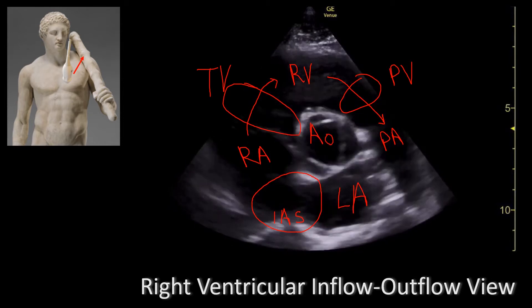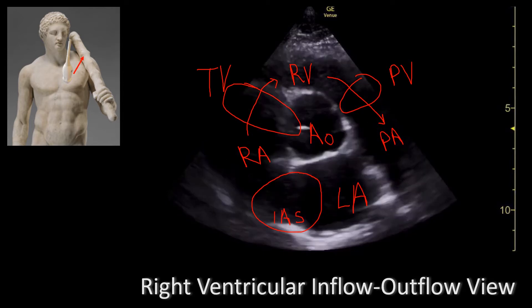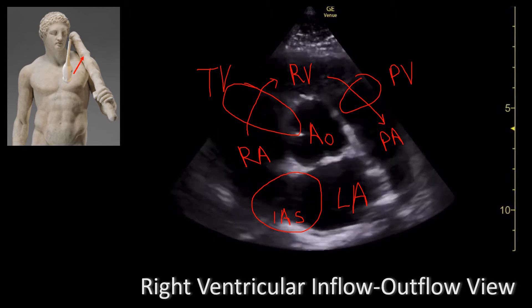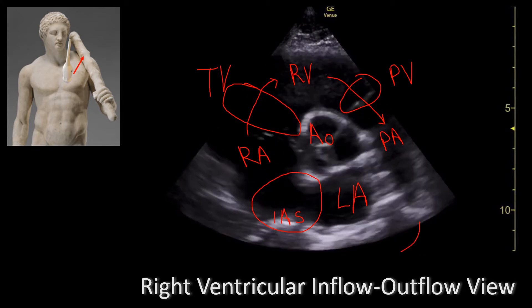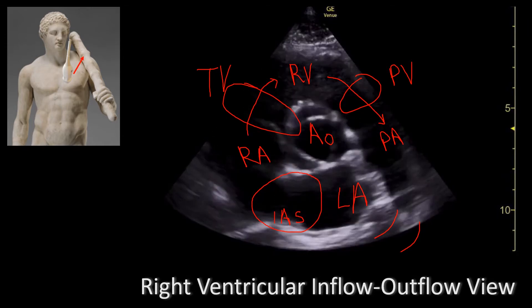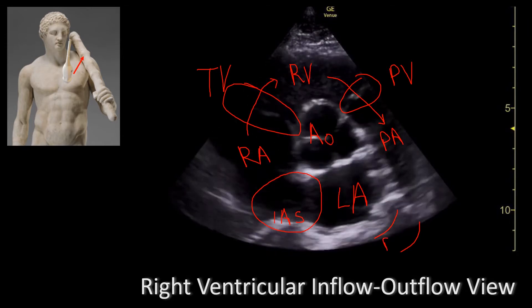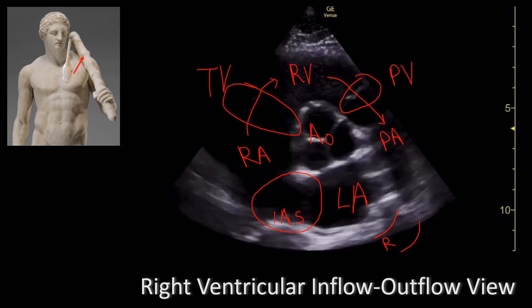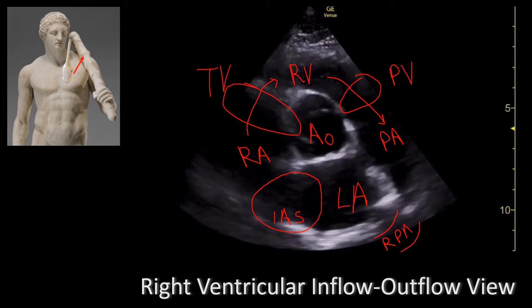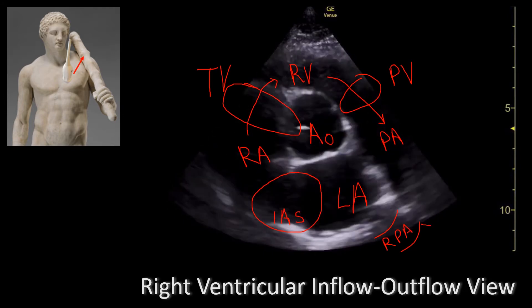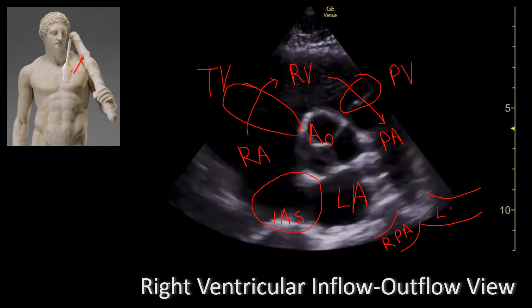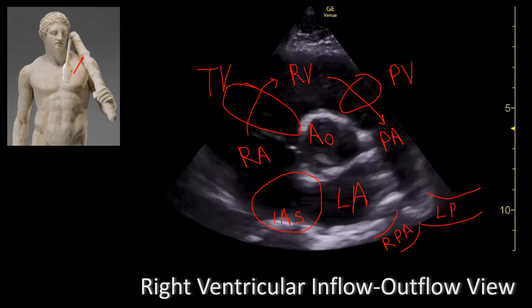In some patients you can actually see the bifurcation of the pulmonary artery right behind the heart. One will be the right pulmonary artery and the other will be the left pulmonary artery.